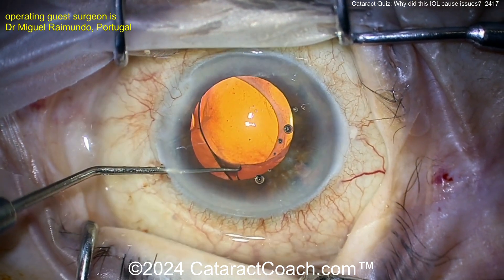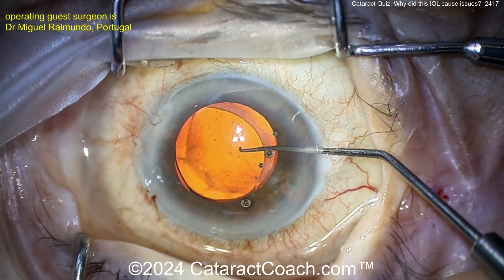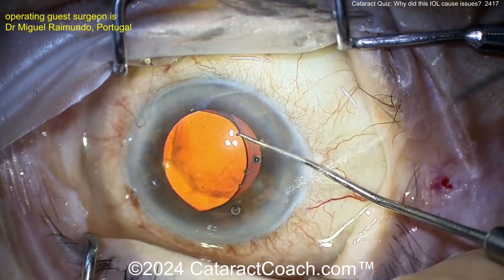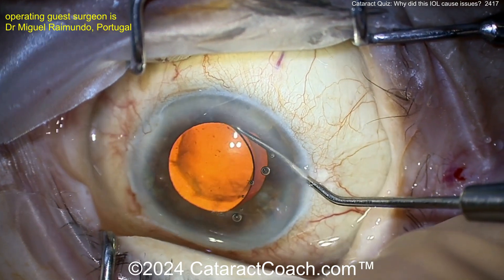You can try to visco-dissect it out, free it up. There's certainly a haptic in the sulcus. You've got to get it repositioned now. Hopefully you can open up the capsular bag enough and get this same lens positioned in the capsular bag — get that second haptic in. At the top of your screen there's the inferior haptic and it's definitely in the bag. It was the other haptic, the superior one, that was dissected out and was outside the bag.